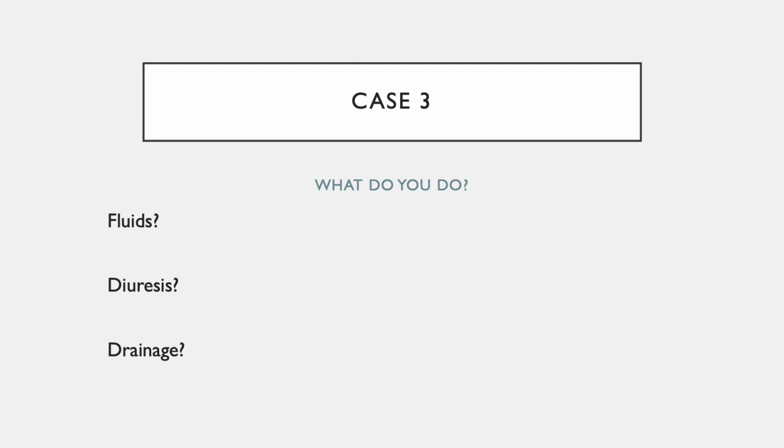So what do you do? The patient was first given fluids, but then given IV Lasix because they looked congested. However, their serum creatinine climbed and they continued to be oliguric. That being said, on ultrasound assessment, the patient still appears congested. As a result, you decide to stick to it and you continue with the Lasix.